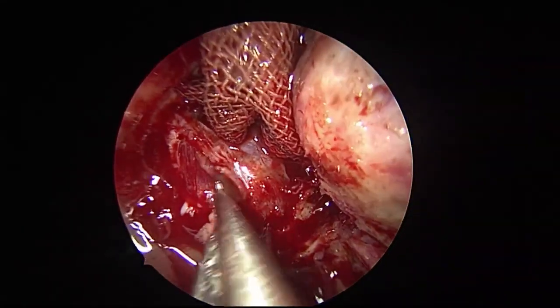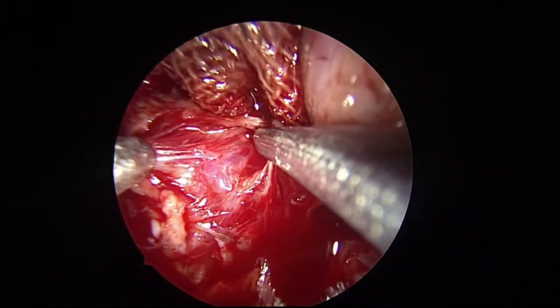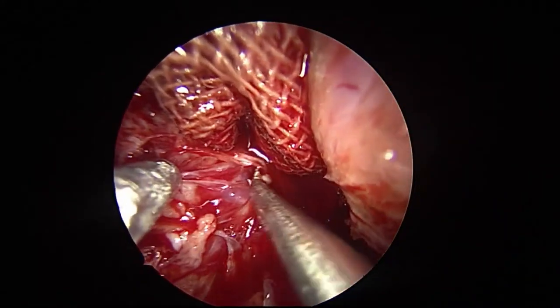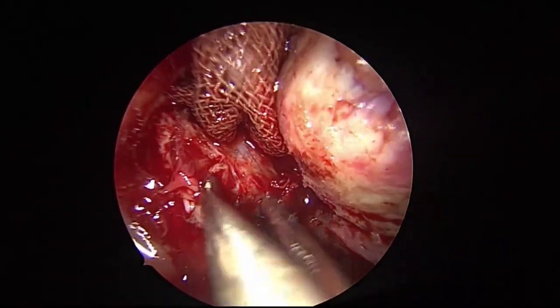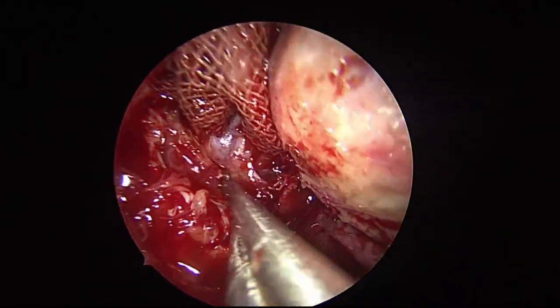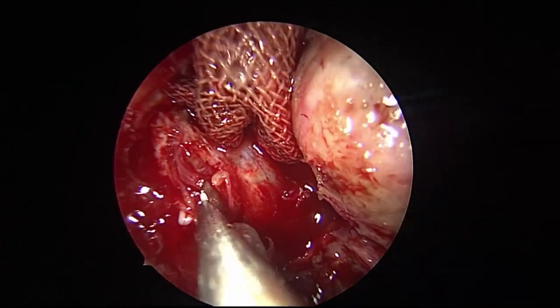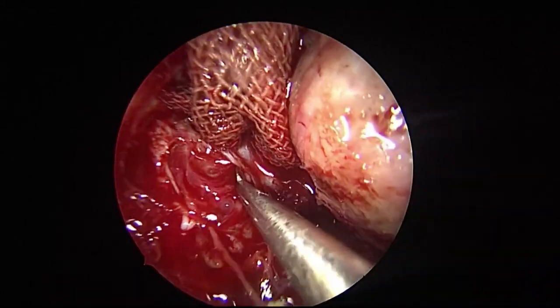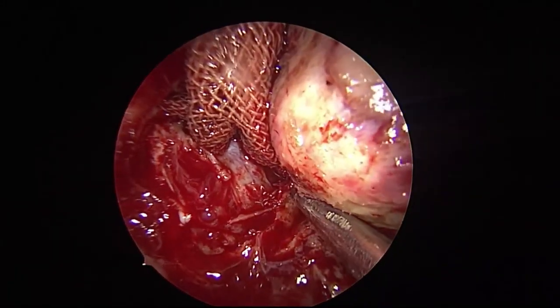Now, see, this is your periosteum. Can you see? Yes, sir. Can you see the vessel behind? Yes, sir. Clearly seen. Can you see very clearly, everybody? Hello. Yes, sir. The loop of the IMAX. Give me the coblator.